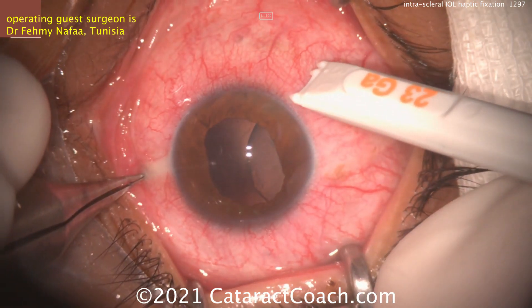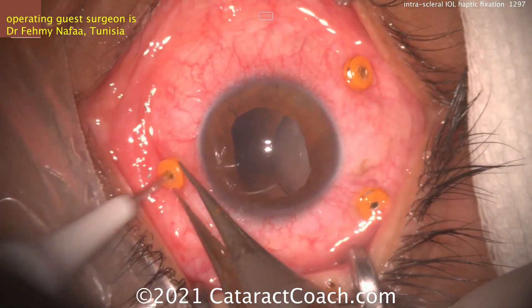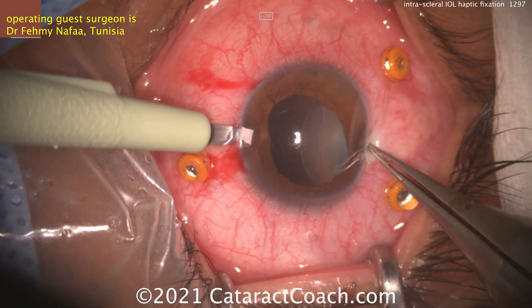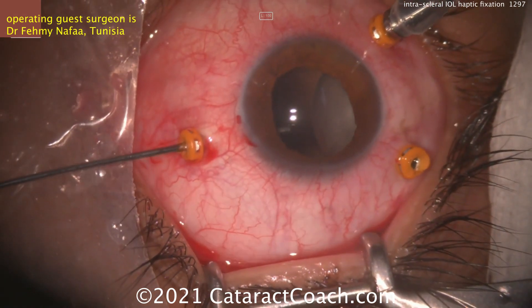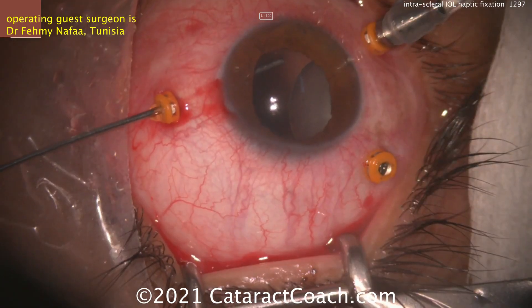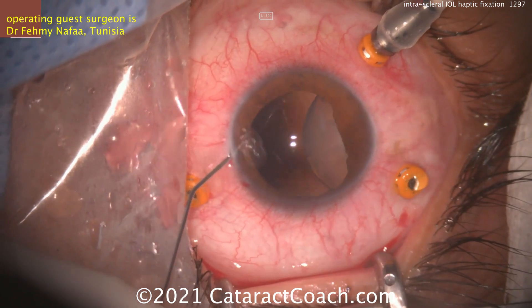Our operating guest surgeon here is Dr. Fehmy Nafaa from Tunisia, and you can see this patient has a very dislocated lens nucleus. It looks like it's relatively soft. Now starting off with the three ports for the vitrectomy and also making some paracentesis incisions. You could perhaps try to bring this nucleus up and inject some BSS, but just think how much zonular support is remaining if that's where the lens nucleus is — the answer is very, very little.